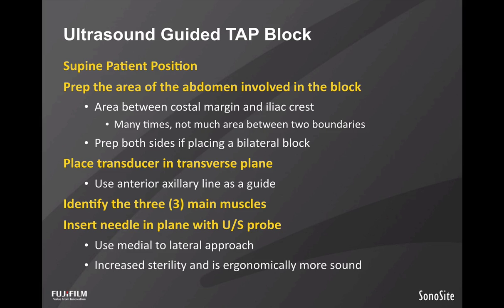In this case, if it's too far, it could be puncturing the peritoneal cavity. So one may also hydrodissect, which means to inject a touch of medication to see where the tip of the needle is. In this block, there is no twitch monitor or stimulation of the muscle that is used, because this is not a motor nerve that we are stimulating, and as such, hydrodissection will not hurt your block.